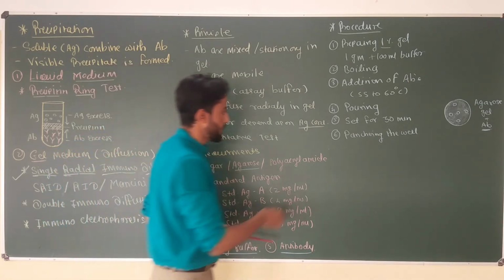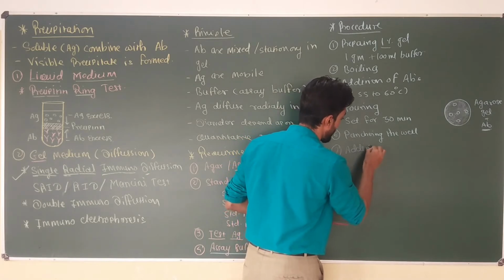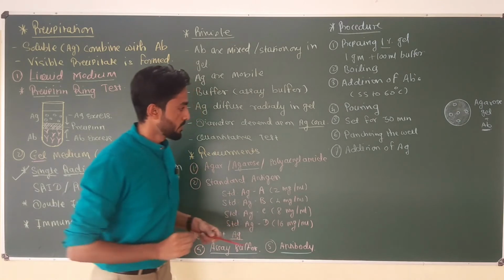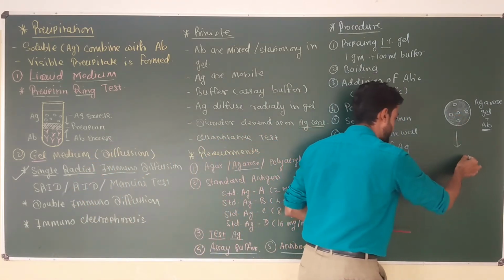So the next step is the addition of antigen. I'm going to draw the same plate again.